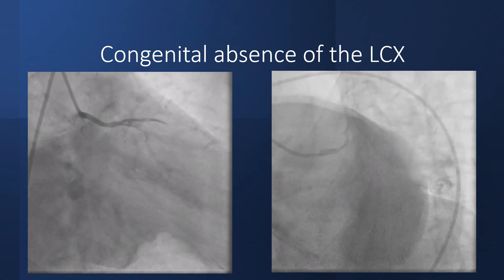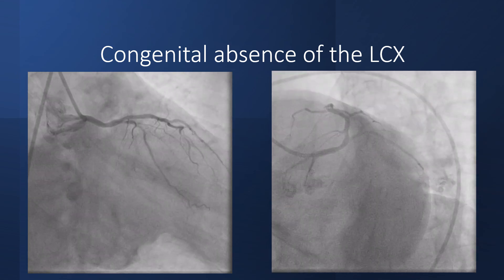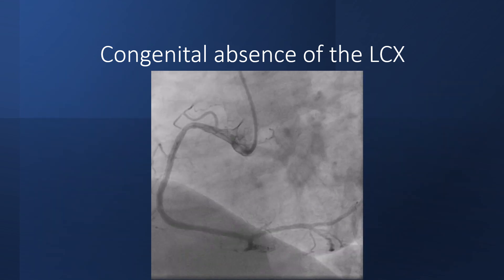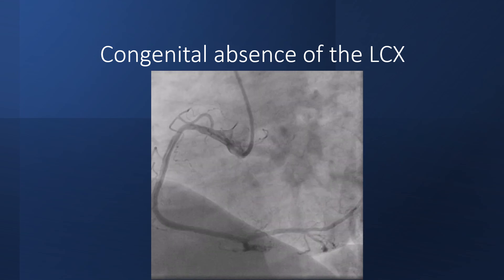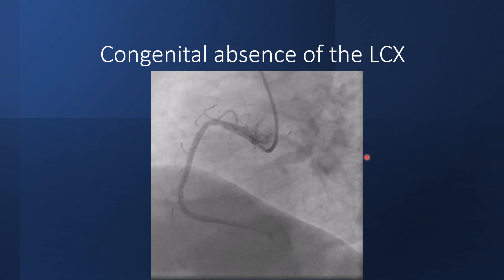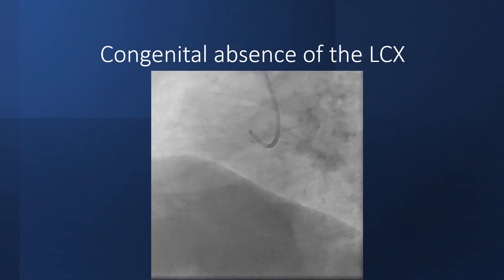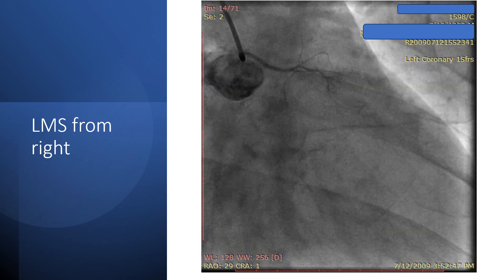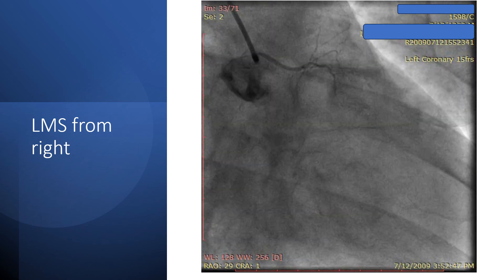The case shows a long left main stem with absence of the circumflex. One would expect the circumflex to be arising anomalously from the right sinus or from the right coronary artery. However, engagement of the RCA didn't show the usual anomalous circumflex, but instead showed a super dominant RCA where the PLV continues upward to supply the area of the circumflex — the posterolateral area. Now we come to the most important anomaly, because in some variants it has clinical importance since it may be associated with the risk of sudden cardiac death.